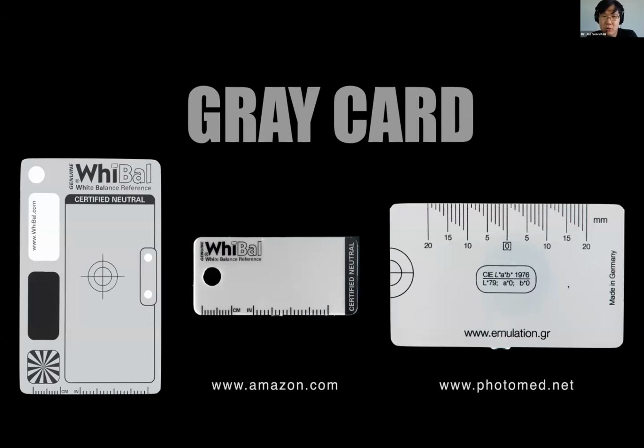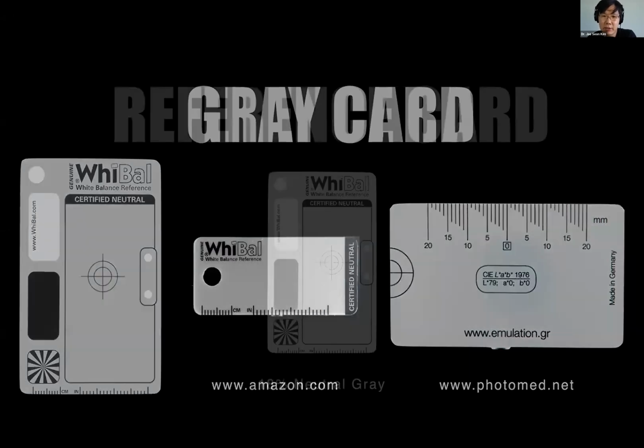One example: I had been taking these photos and sending them to a local lab for my posterior crowns. After about three months, they finally called me up and said, "Hey, Doc, why do you have those weird gray things in the background?" They had no idea why I was sending those photos. They weren't calibrating any of the photos. So you need to have your lab in on this too. You need to make sure they understand why you're doing this, and that they have the correct software to color correct the photos you're sending.